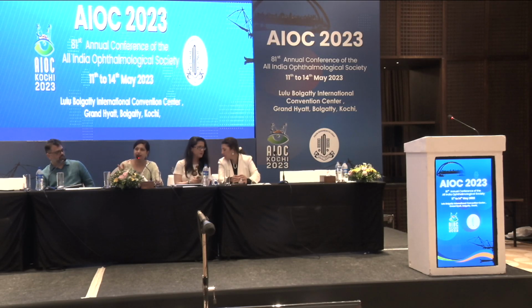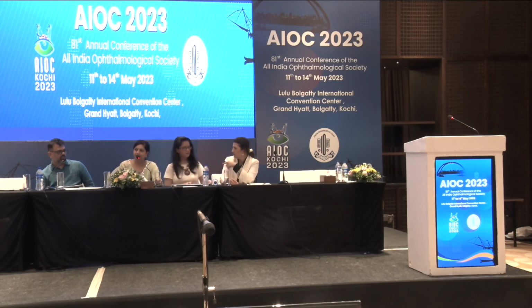If it's more than that and you have proven it yourself, then it would probably be better to do an IOL exchange. If it's somebody who has been referred or has come to you for a second opinion, and it is maybe a few months beyond the first surgery, then there's no question of IOL exchange because fibrosis has already set in. And then probably you can think of a laser touch-up, but you cannot do it for a very high ametropia.